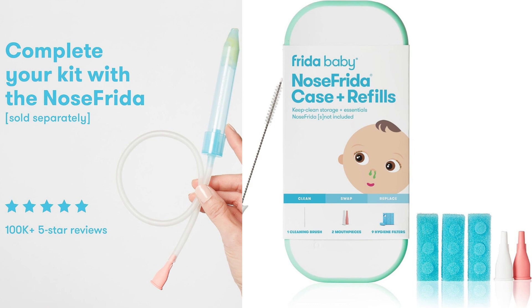In terms of performance, the Nose Frida Case Plus Refills does exactly what it's intended to do. It keeps all the components of the Nose Frida together in one place, making it easier to find and use when needed. The case is easy to clean, and the filters can be replaced whenever necessary, ensuring that the Nose Frida remains in optimal working condition.